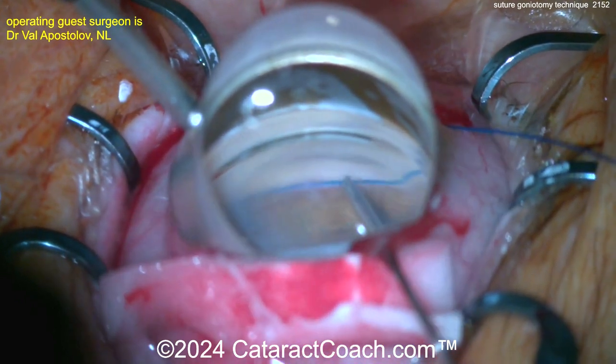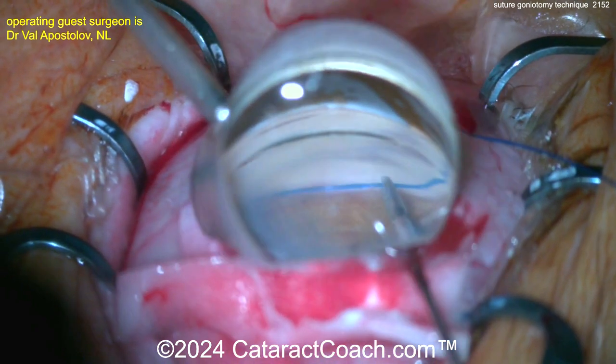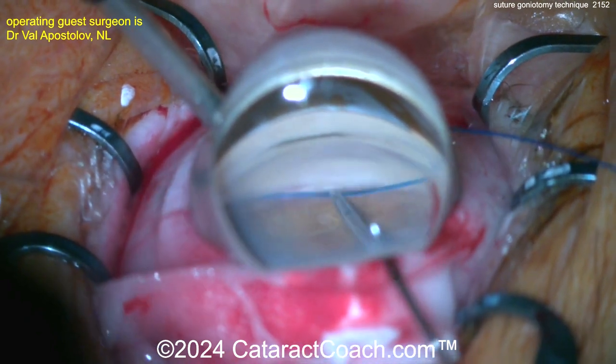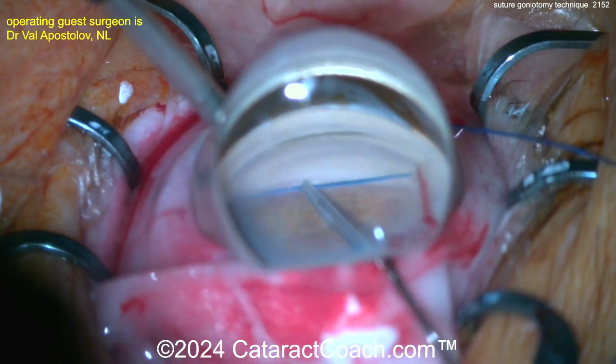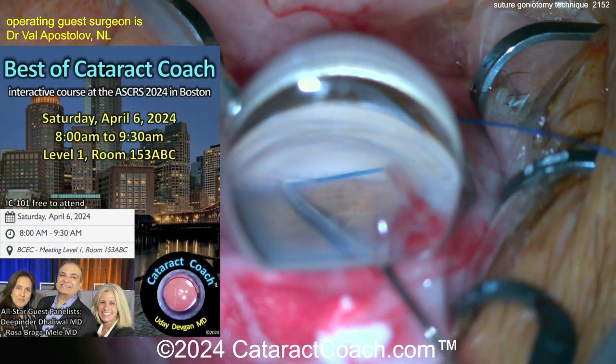Slowly but surely passing it around. Another hint: keep blood off the surface of the cornea, because that will obscure your view with the gonioscopic prism. We're advancing it — this is a 5-0 prolene suture — and that looks pretty good.